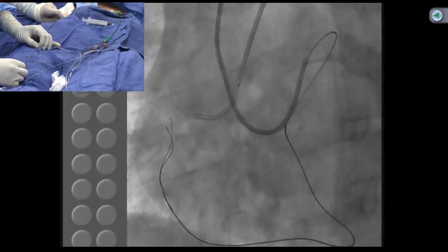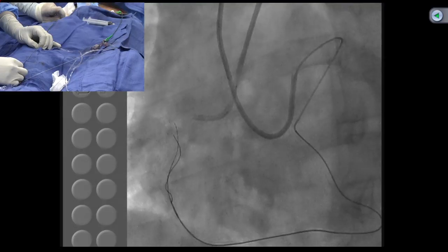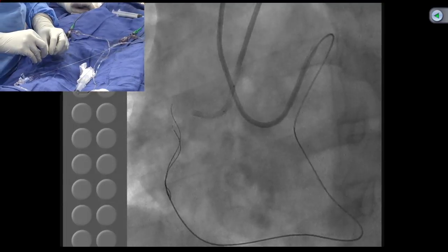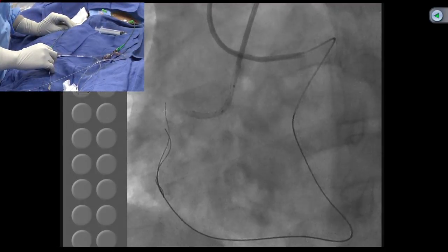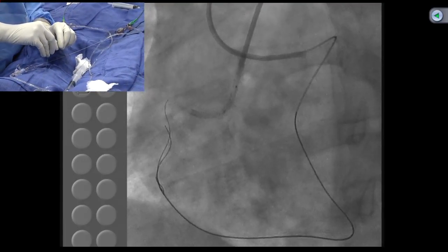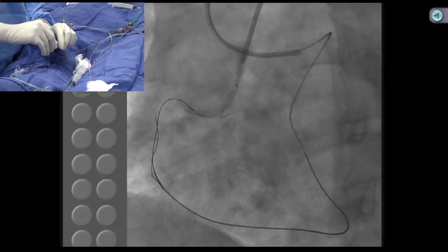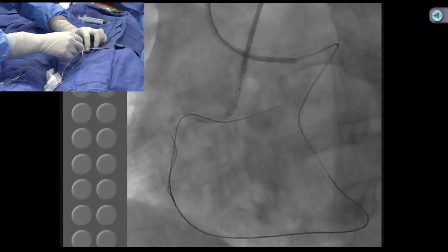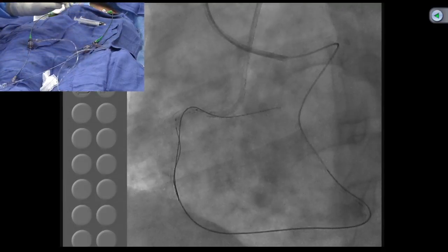Yeah, the guide is a little... Take a deep breath. Yeah, these guides are just a little sucked in, both the guides. Breathe normally. Good. Pressures are good. These are all sucked-in guides. Therefore, it's also important we use side holes for the right coronary in these CTOs. Very common. People say, well, there's a lot of contrast, but I can tell you, and I've seen many of these cases live, that clearly using the side holes prevents that spasm, slow flow. So I'm very particular about using a side hole for the right coronary.